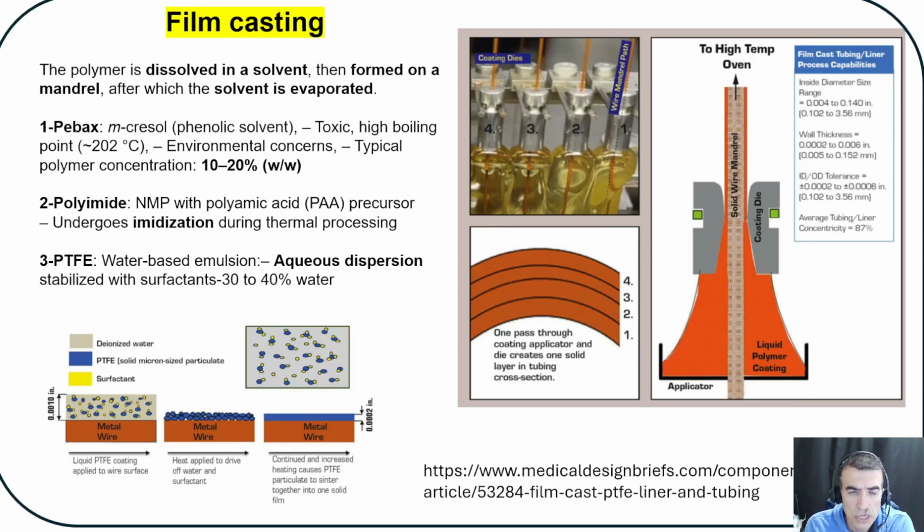So as I mentioned, you do this in a layer by layer form, and each layer you do like 1/10 of tau. The reason for that is that this would give you controllability over the process. If you go too fast, there is a chance for solvent to get trapped.